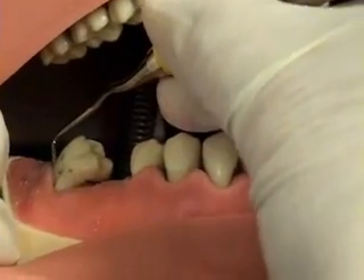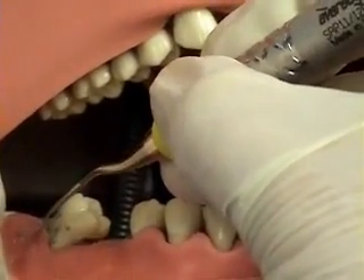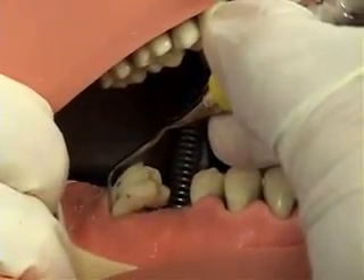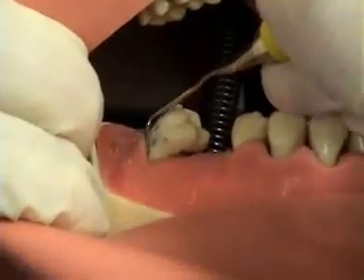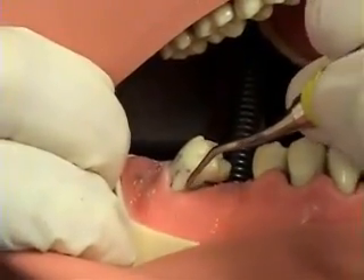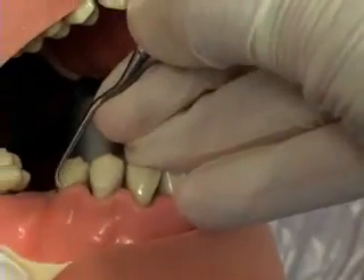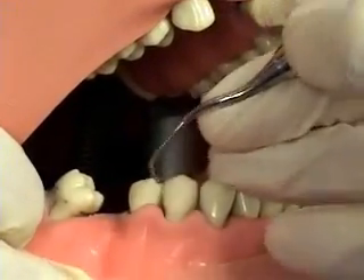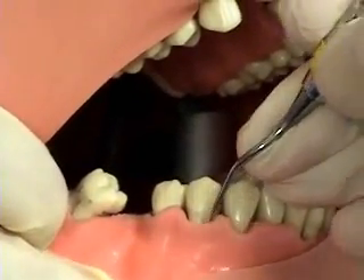Next is the 11-12, used for the mesial surfaces. This instrument can be used both from the distal line angle into the mesial, or starting at the mesial line angle into the mesial. The lower terminal shank is kept parallel to the long axis of the tooth, and the toe one-third of the instrument is kept in contact with the tooth at all times. Notice the nice parallelism of the terminal shank on a tooth that is tilted in a mesial direction, and how the clinician rolls around the mesial line angle right into the mesial to get under the contact.